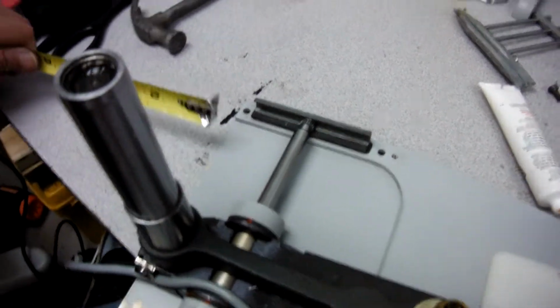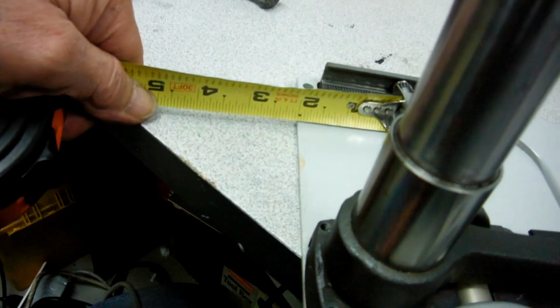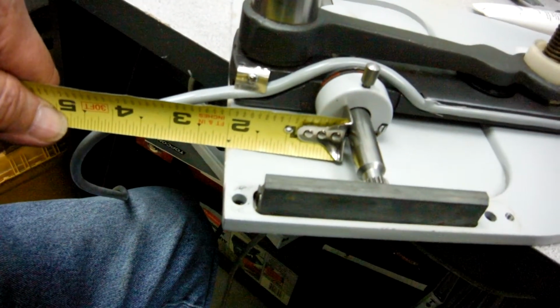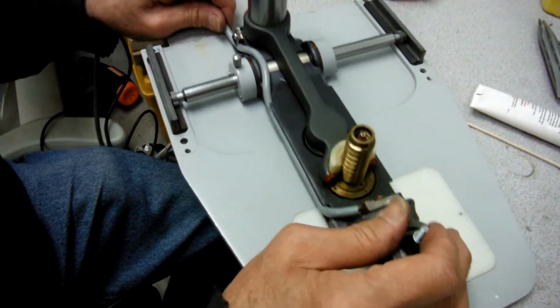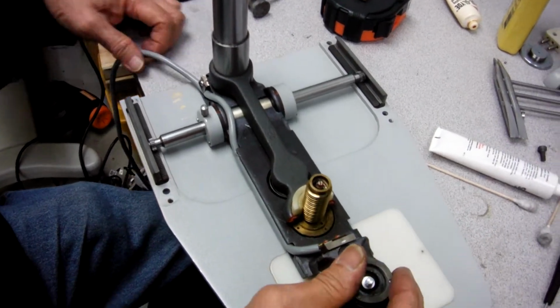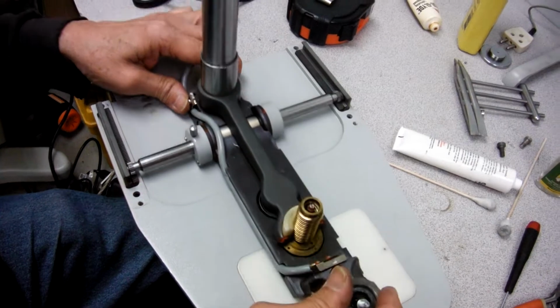Again, let me show you one more time. Put the tape in here, and let's say right here is 2 inches, on the other side 2 inches, on this side. That means the shaft sits straight. Okay, and then you can move back and forth and see how it feels. If it feels good, that means you already cleaned your shaft and it works fine. Move back and forth, front to back.